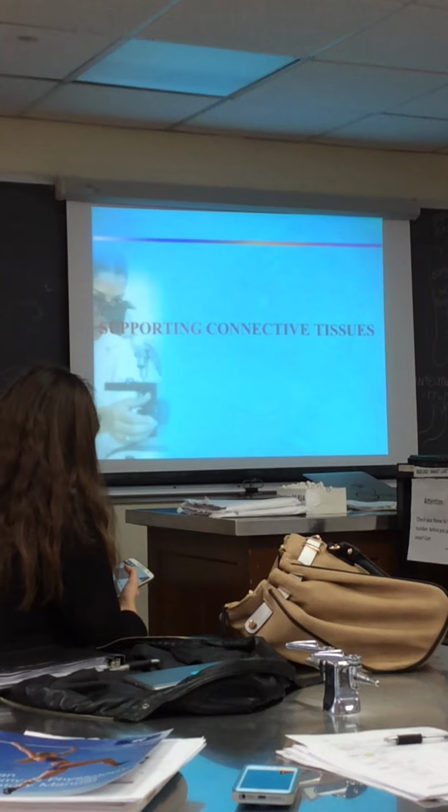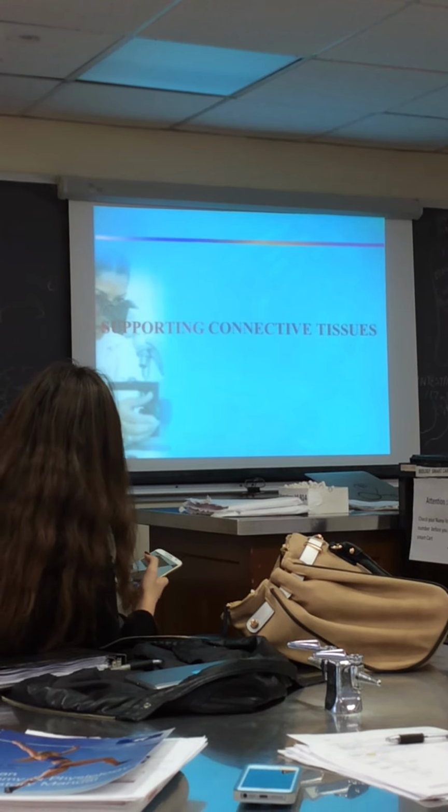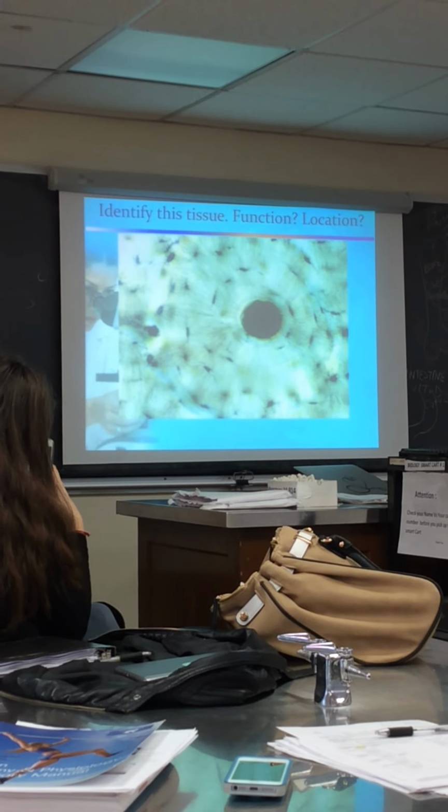Any questions about fibrous tissues? Let's move on to supporting connective tissues, the last category. This is the easiest. Everyone should know this tissue. What are we looking at here?